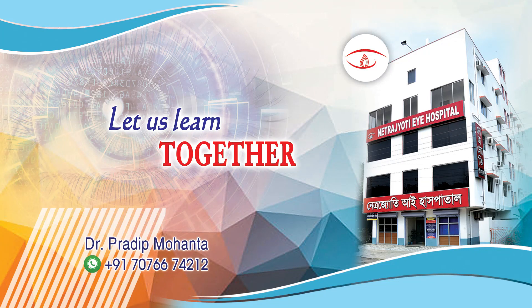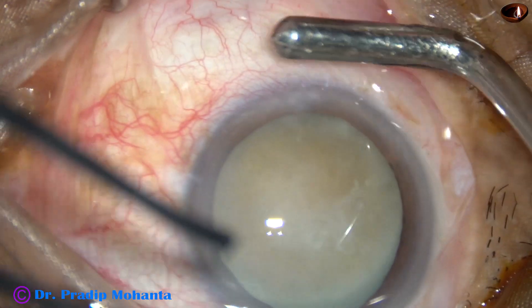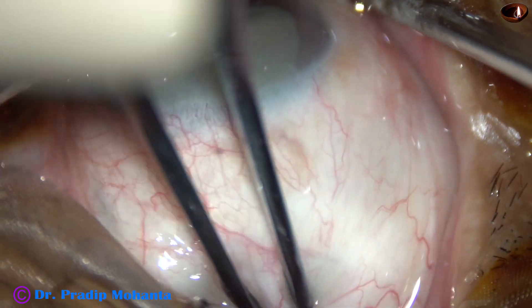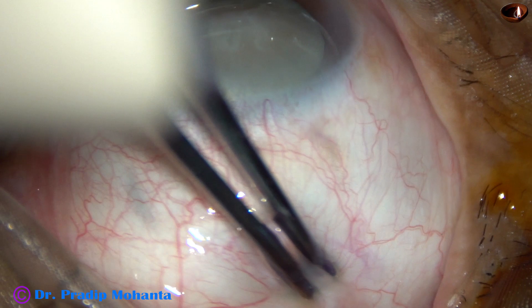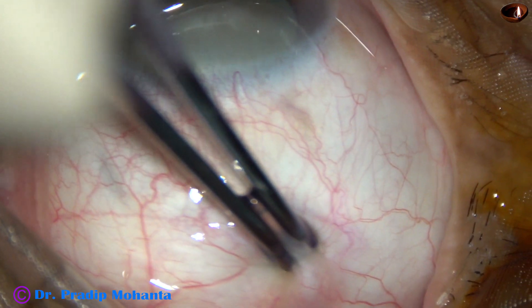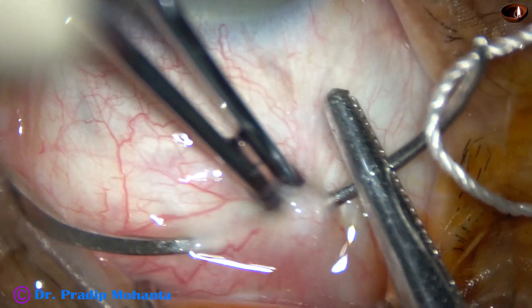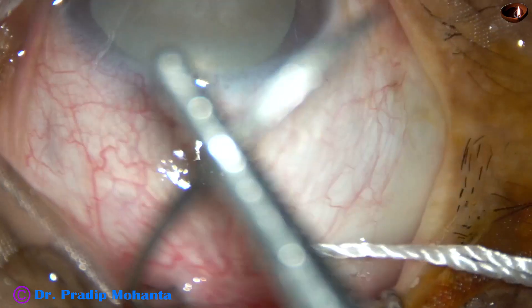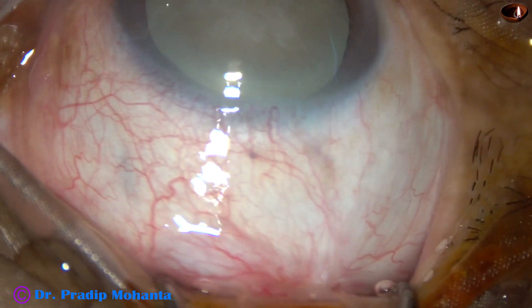Friends, welcome to my workplace at Ranaghat, West Bengal, India. This is a hypermature morgagnian cataract with a hard nucleus. In this case, I am going to do LICS, that is Large Incision Cataract Surgery. We can also call this DSICS, that is Double Small Incision Cataract Surgery. We are going to see that in a very short time.